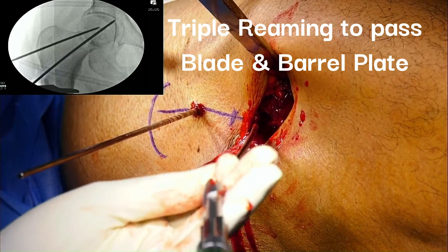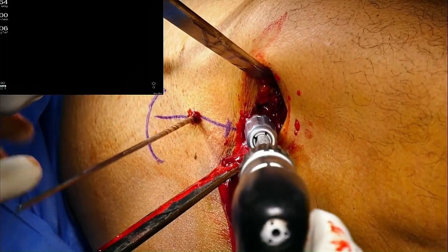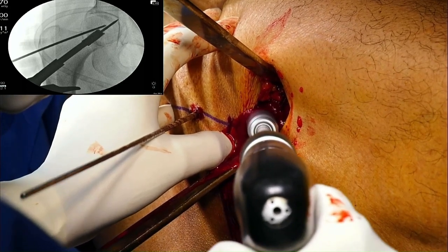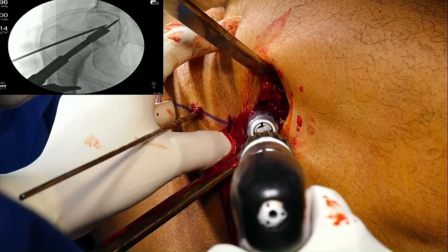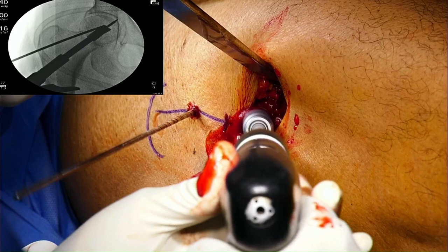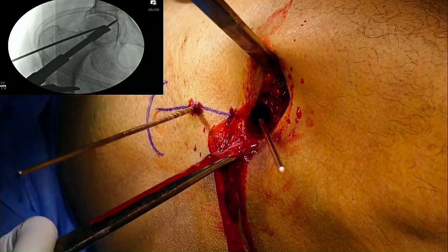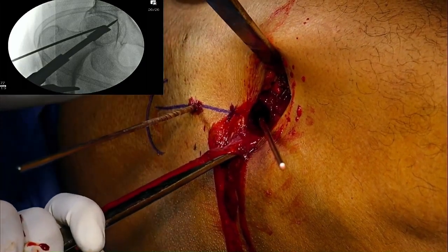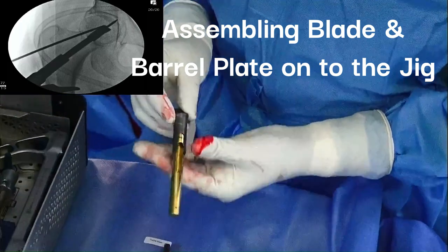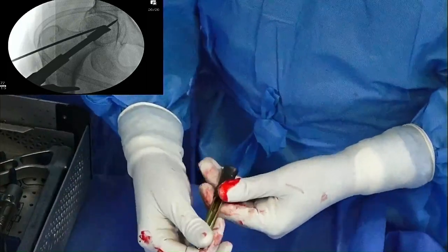I put the triple reamer at 100mm. Shoot — the third part of the triple reamer should make a hole — that is just touching the lateral cortex now. Otherwise the plate will not sit flush. I think this length is okay — 100. Now I'll assemble the jig with the instrument. This is the 100mm screw I'm using — I'm putting this in the barrel. It cannot rotate here because of the slot, it can go only in one direction and it won't rotate. Now I'll apply the jig.